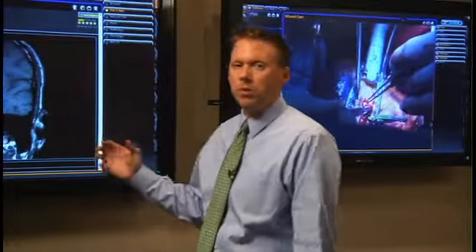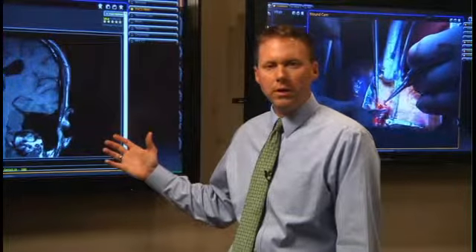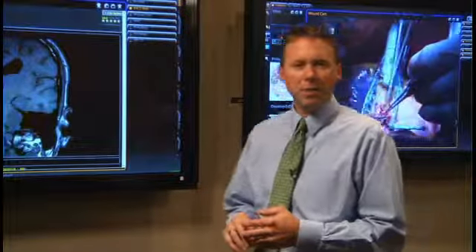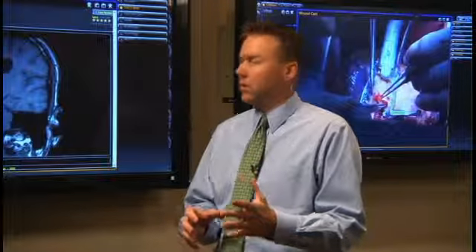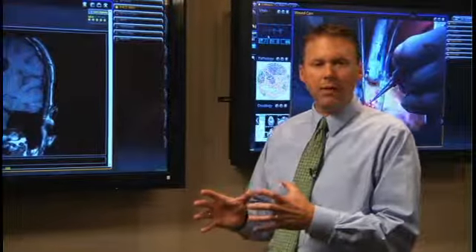Being able to remotely access those during a case is a very powerful differentiator that you can bring to the table as an organization, because usually they're printing out paper copies or they're burning their own CDs on their own viewers, and they're having to remember to get those to the operating environment before they start surgery, or else they potentially have the risk of canceling a case. So those are just a few practical examples of where just inherently within the platform we've solved these problems of having that flexibility to be able to access that information.